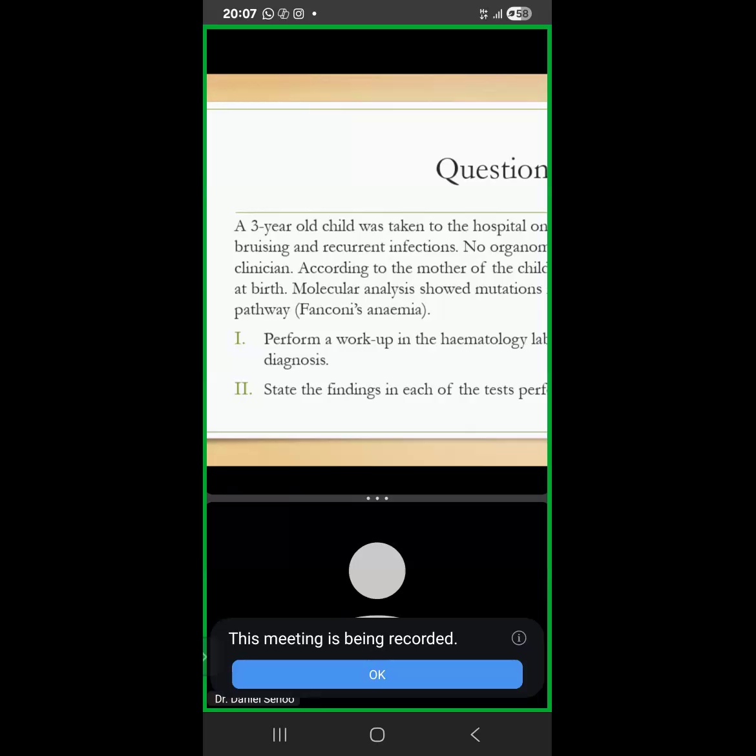Yes. If we are seeing aplastic anemia, is it not under bone marrow failure? We are now looking at the peripheral blood film. We are doing a workup. So you are jumping to bone marrow, likely things that you see. We have to see how we can make a firm diagnosis. And so we have done full blood count. We are looking at peripheral blood smear. And then we'll do bone marrow aspiration.